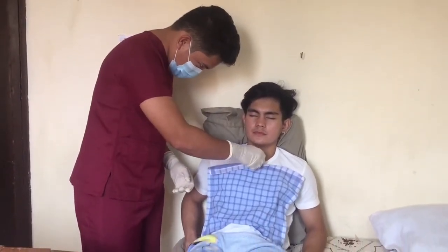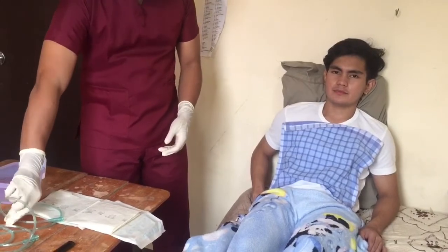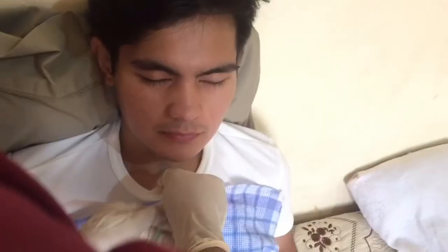Next is the endotracheal suction. Disconnect the patient from the ventilator and introduce the suction catheter gently to the required depth. Apply suction for 5 to 10 seconds while slowly withdrawing the catheter. Then remove your finger from the control and remove the catheter. Clean the catheter and repeat suctioning as above. Wipe off the catheter with sterile gauze if it is thickly coated with secretions, and dispose of the used gauze in a moisture-resistant bag.